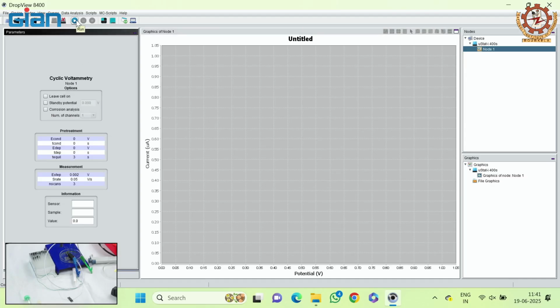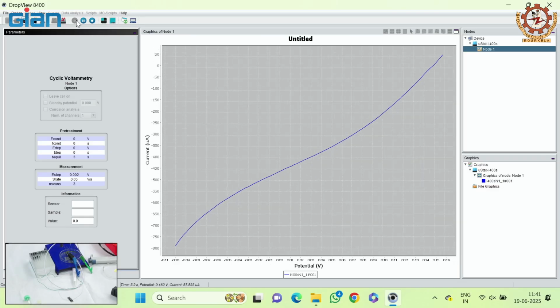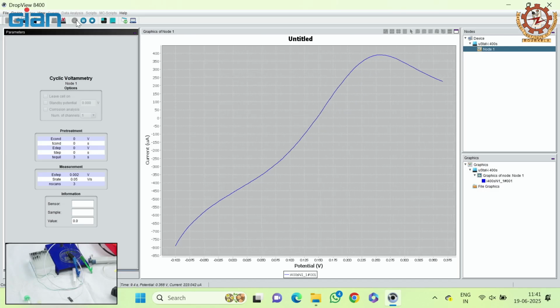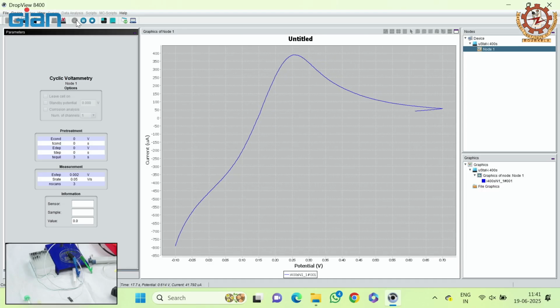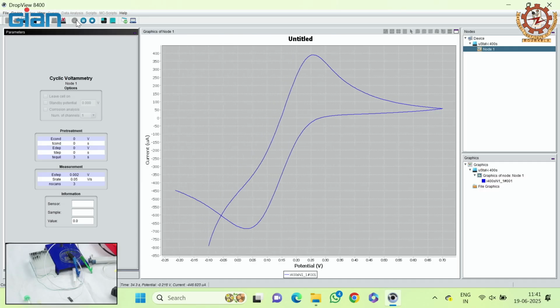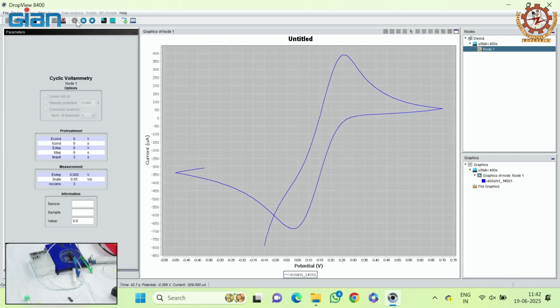So, as you have seen earlier, it is a triangular voltage sweep that is performed between the working electrode and the reference electrode, and the current is measured through the counter electrode. So, you can see on the screen CV has started. This is the oxidation peak. First scan completed. We have oxidation and reduction peaks. So, it will continue like this 3 times, performing 3 scans.